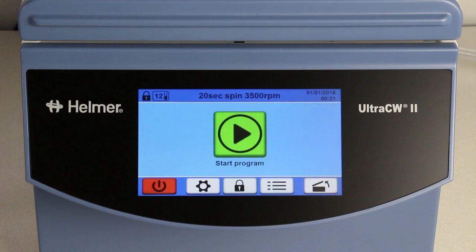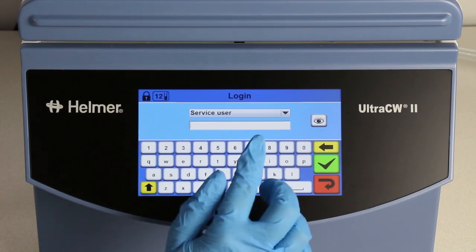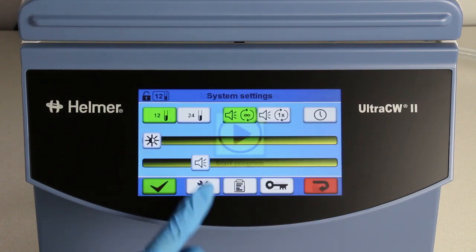To go to the system settings screen, first log in as a service user by selecting the lock button and entering the service user password provided in your quick reference guide. Then select the settings button from the start screen.